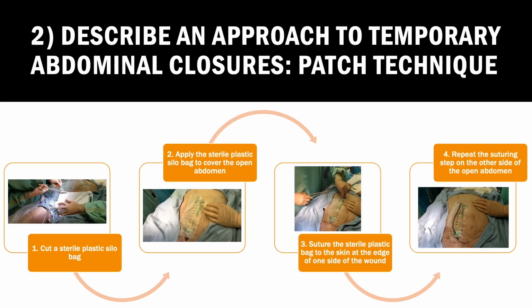Part 2. Patch technique. Here we will describe the steps to performing a temporary abdominal closure using a patch technique. The general approach is as follows.